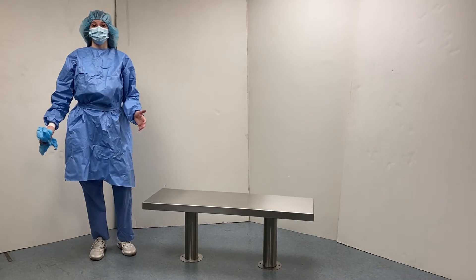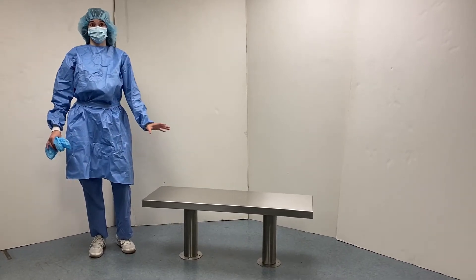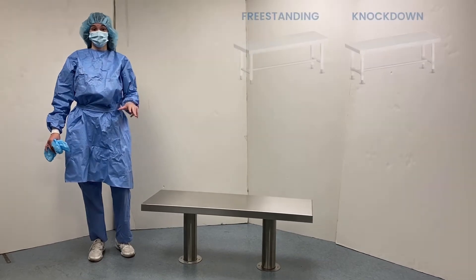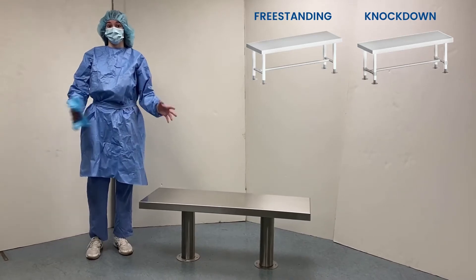This is a video on Blickman's new product line of gowning benches. Today we'll be looking at the mounted gowning bench specifically, one of three models. The other two being a freestanding model and a knockdown model, both of which can also be mounted to the ground.